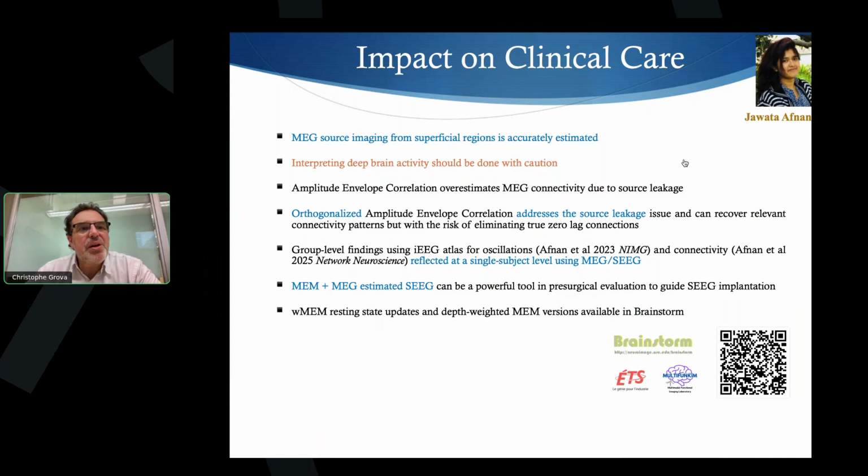I'm relatively more convinced that the more we can put into the problem, the better, because the problem is ill-posed, as we all know. And of course, if you put a single dipole, you can have any orientation, and as was shown largely by Dr. Bersol and others, the orientation of that dipole is quite informative per se. I do believe that source reconstruction along a cortical surface, by fitting the orientations or keeping them a bit loose, is also quite informative, because we believe strongly in the anatomical support where those data are generated.